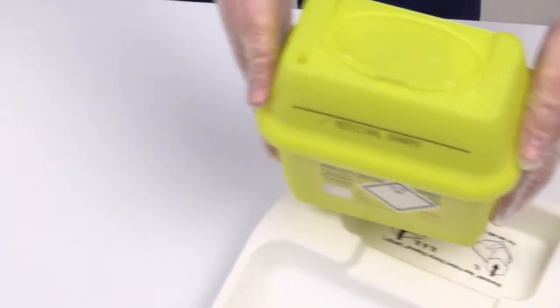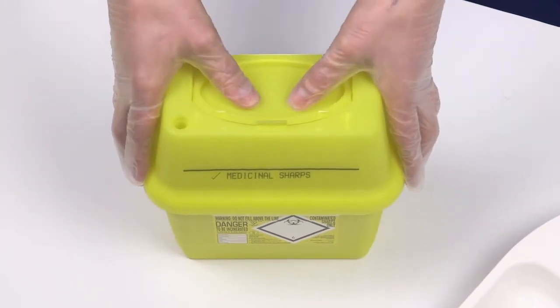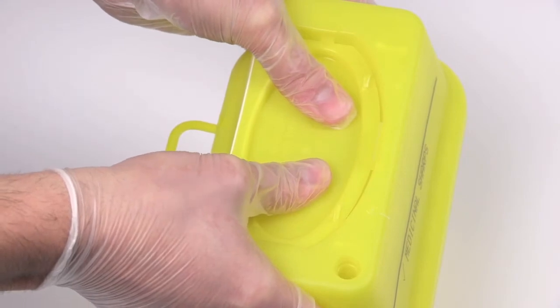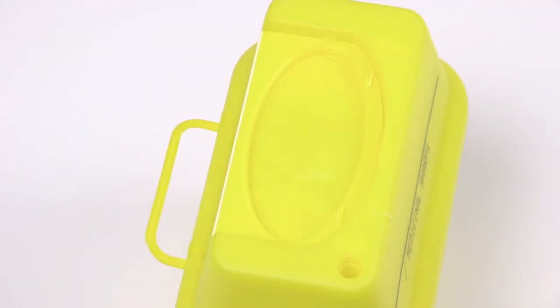Place the container onto a suitable surface to engage final closure. With the container in temporary closure, press down firmly to engage final closure. Ensure all three clicks are heard to indicate final closure.